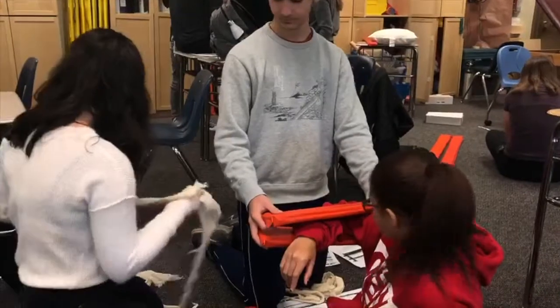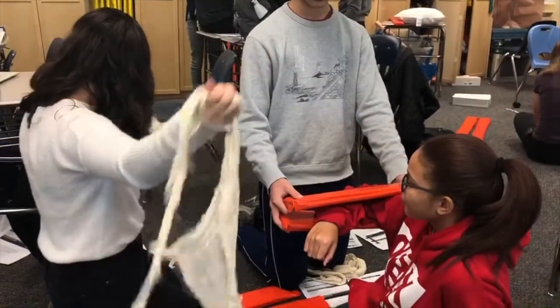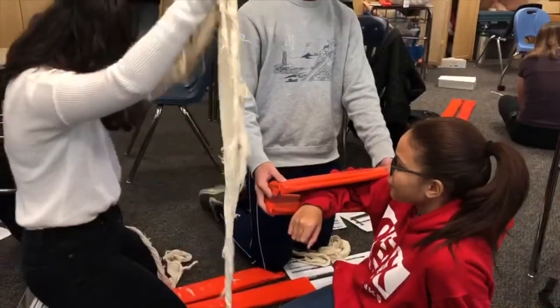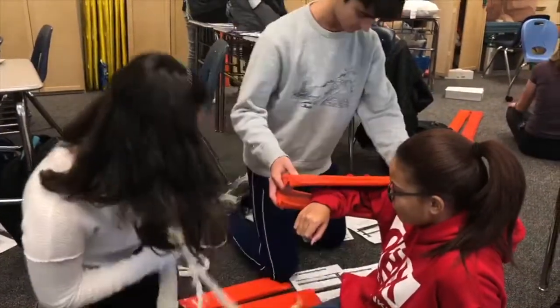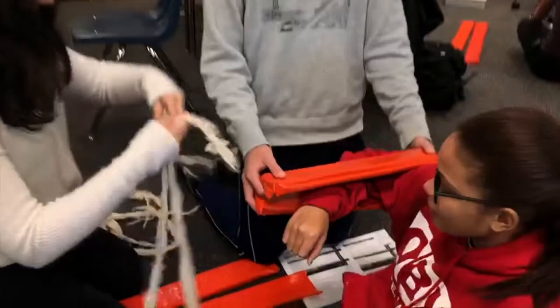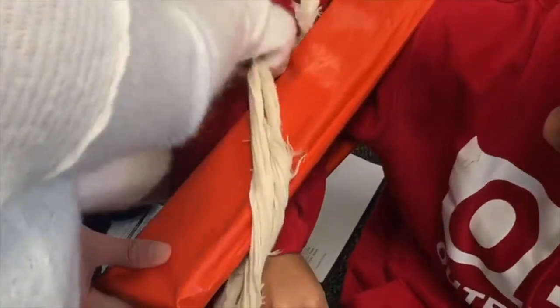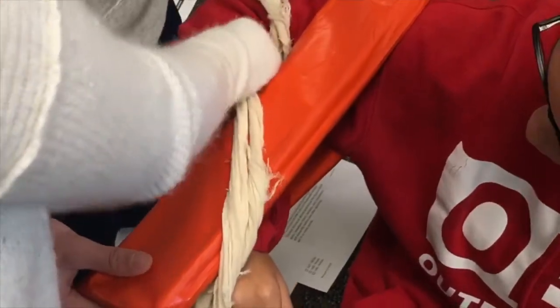So then you're going to take two cravats. Which ones are the short ones? This one's a short one. So you're going to take two, and you're going to take them both through — all the way down. If they're wearing a sweatshirt, it's really hard. All the way through.